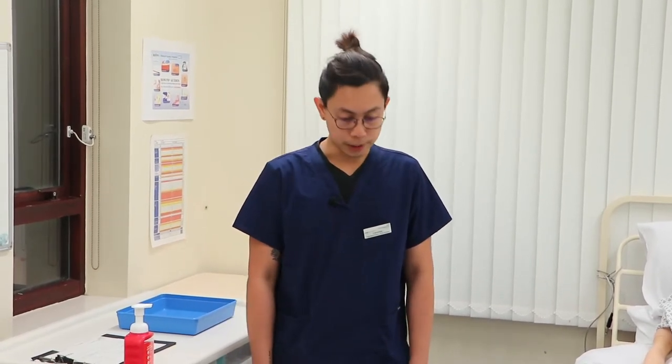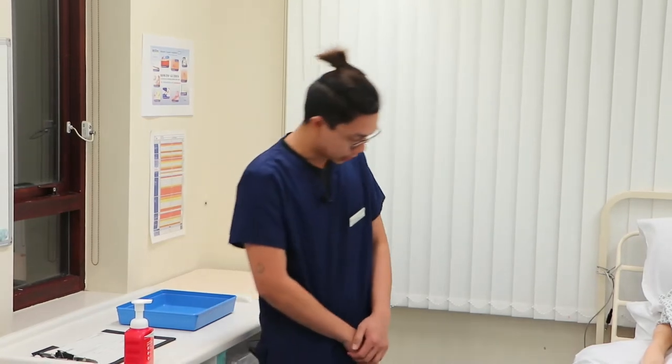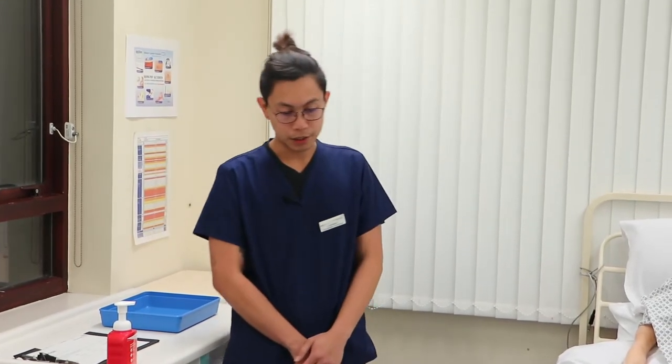I'm going to perform a visual infusion phlebitis assessment or VIP assessment and cannula flush on my patient. First, I'm going to make sure that the scene is safe, free from any cords, cables, and clutter that may pose a risk to the patient, me, and others.